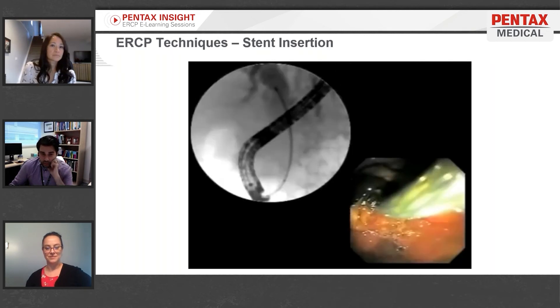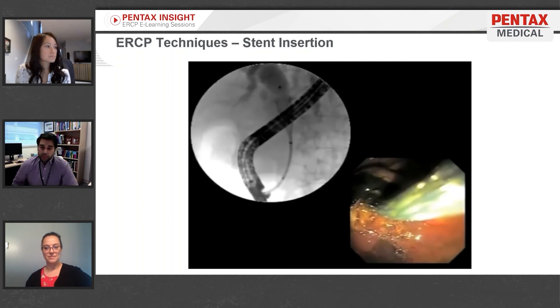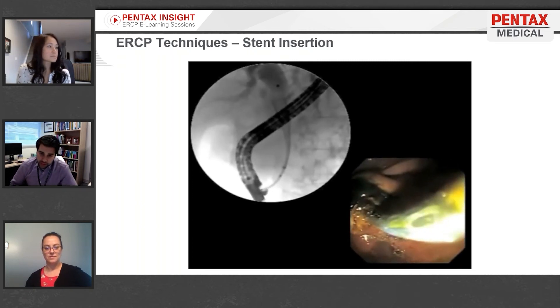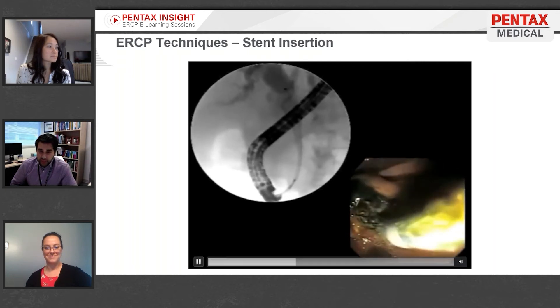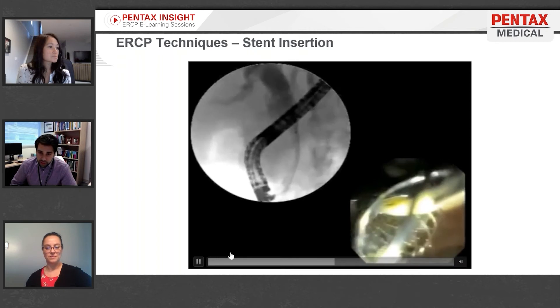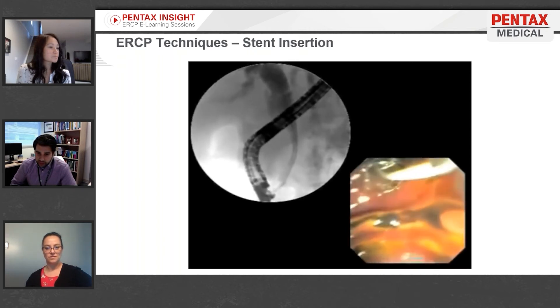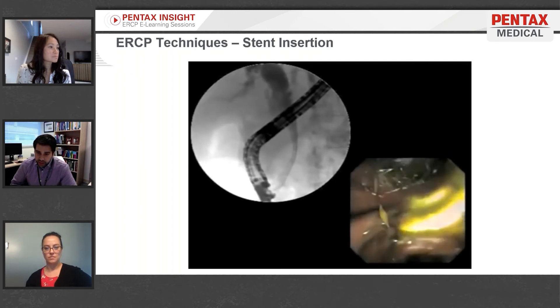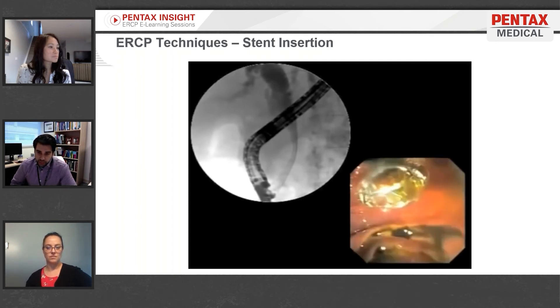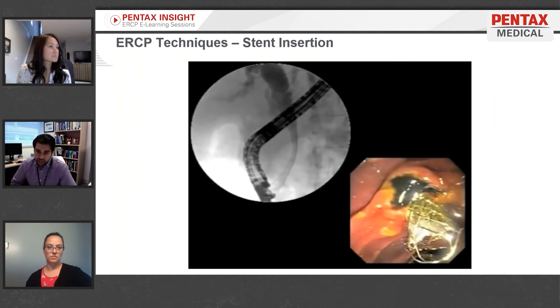The final video shows the deployment of a stent. Here you can see the tandem fluoroscopic and endoscopic images used in ERCP. On the left, the stent is being opened out and you can see it gets narrow — there's a waist — right at the obstruction. On the right, endoscopically, you can see we like to keep a centimeter or two out into the duodenum so the stent is doing its job.